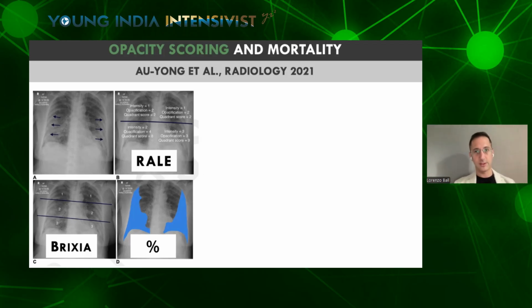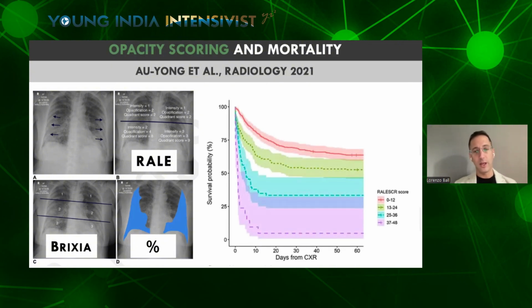Many of our radiologists and technicians do not know about these functions, but what is nice about this study is that it demonstrates, in a cohort of patients with COVID-19, as you expect seeing that it was published in 2021, that the RALE score, one of the four scores, was apparently the one performing better, in which a low score was associated with low mortality and high scores with a very high mortality. And you see that the discrimination between four classes of this score is very good.